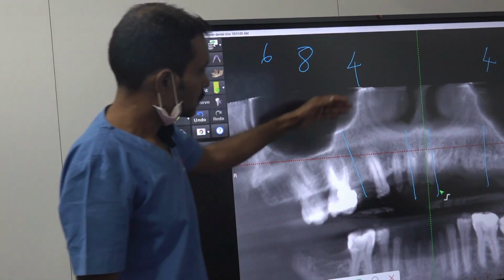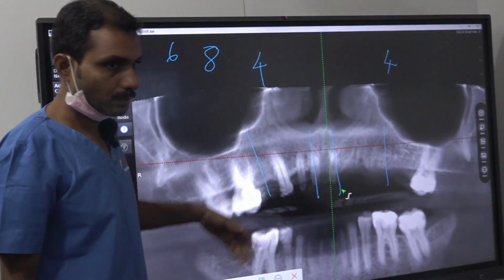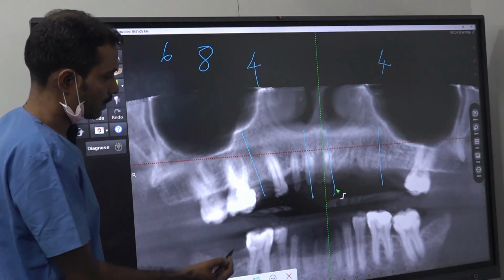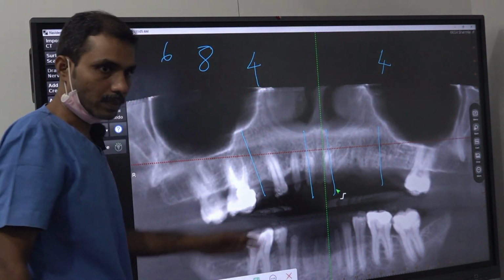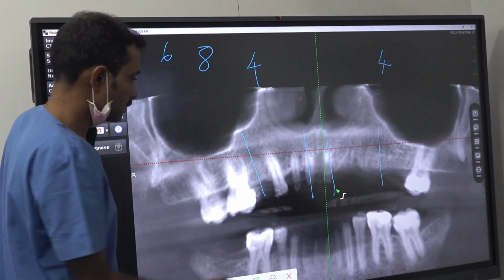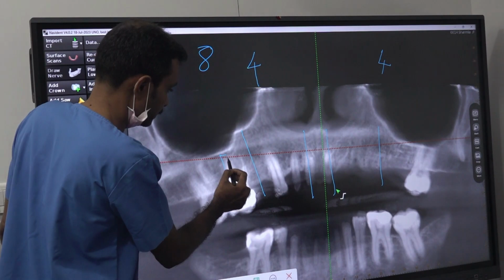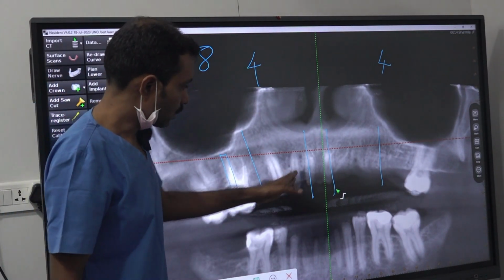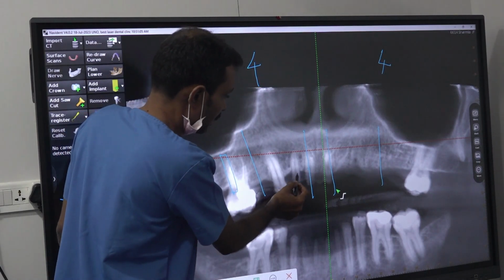Okay. So out of 4, 2 implants we placed. Another 2 implants is there. In between, 1 implant we have to place here, and distal support you need to place 1. So in the molar area, the palatal socket I will be placing another one, and 1 more implant either in the canine or lateral or in between lateral and canine.